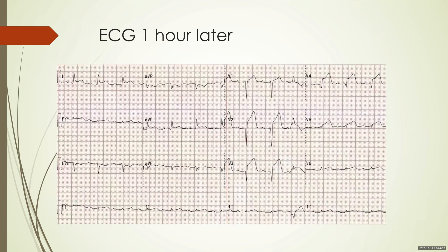One good ECG deserves another. You should never look at an ECG in isolation — always take serial ECGs. An ECG was taken one hour later and now you know the diagnosis. You can see ST elevation in leads V1, V2, V3, V4, V5, V6, and a bit of ST elevation in leads 1 and AVL. This indicates an extensive anterolateral MI.